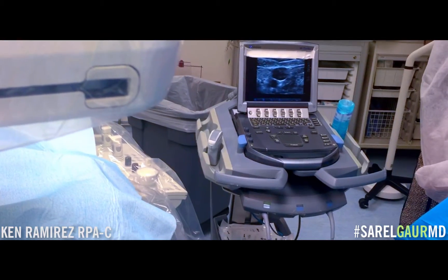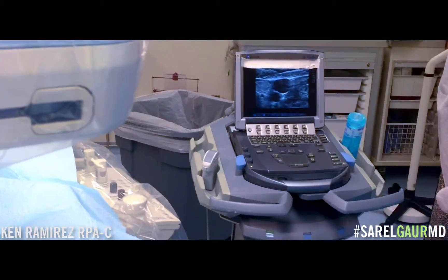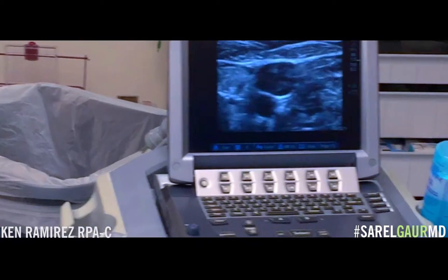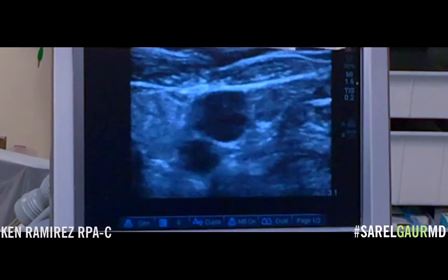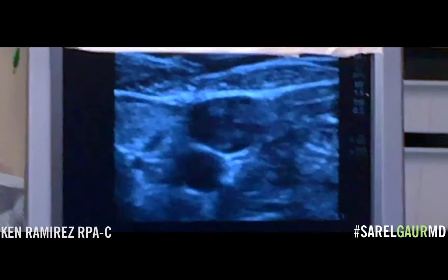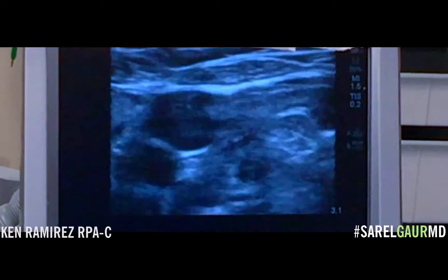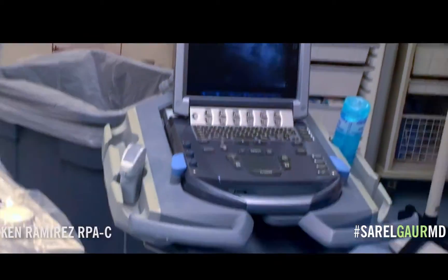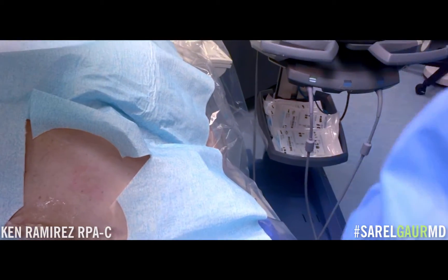The larger vein above is the jugular vein, the right jugular vein, and the dark circle below is the right carotid artery. We are going to access the right jugular vein.